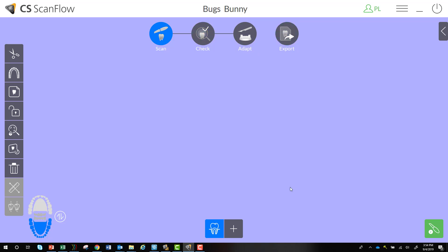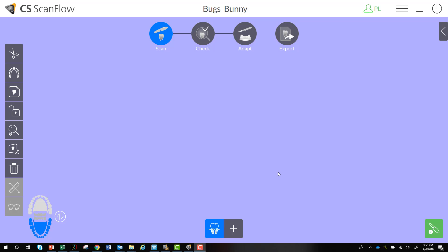Every scan you take is going to start out with a common scan. You can choose additional workflow options like pre and post, scan body, or impression scan after the fact. Every scan starts with your common scan, as you can see down below. If you want to change your workflow from a normal restorative case to a pre and post or a scan body case, you select the little plus symbol.